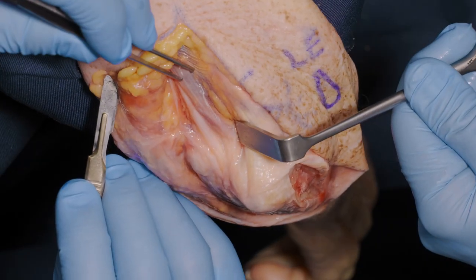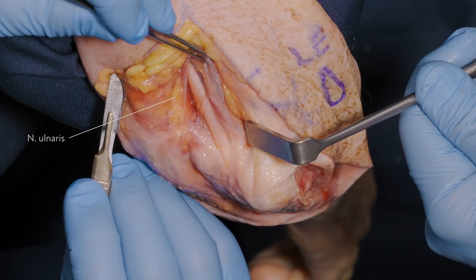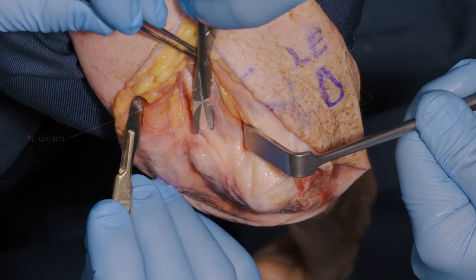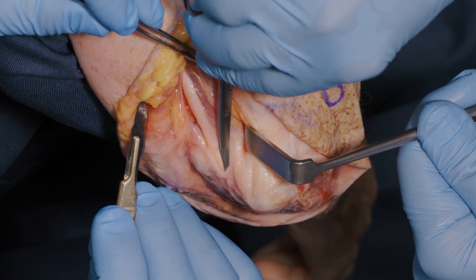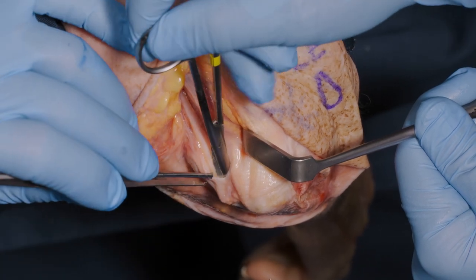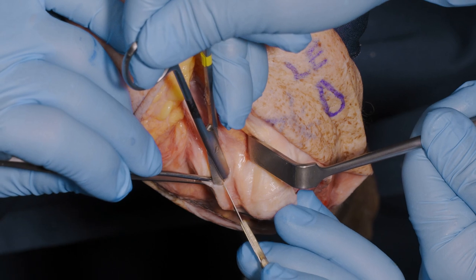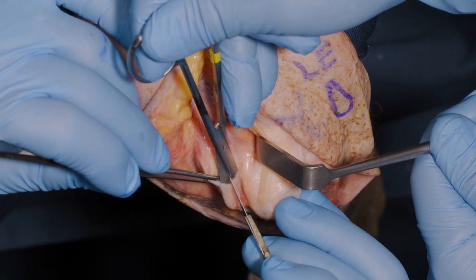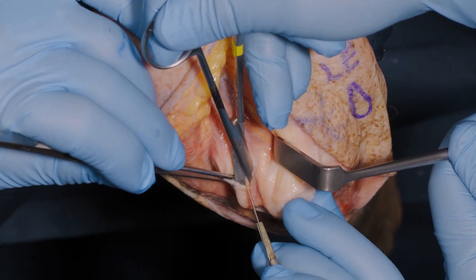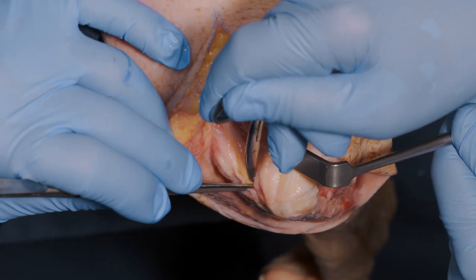The nerve is found under the medial border of the triceps. A good safe trick to identifying and then elevating and freeing the nerve is to pass a pair of small iris scissors into the canal and then incise the roof of the canal, protecting the nerve from harm as we do so.